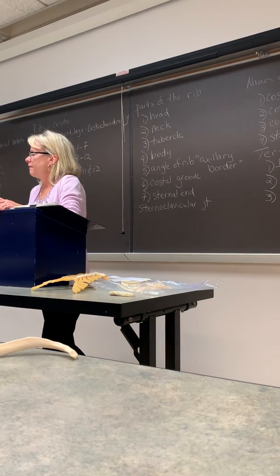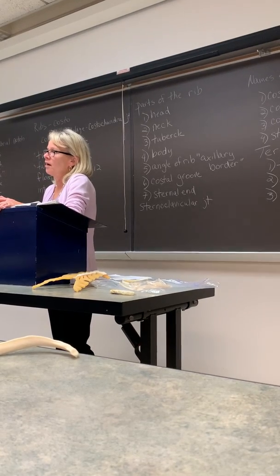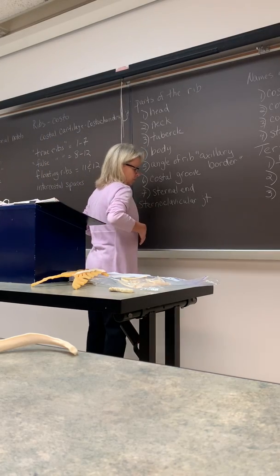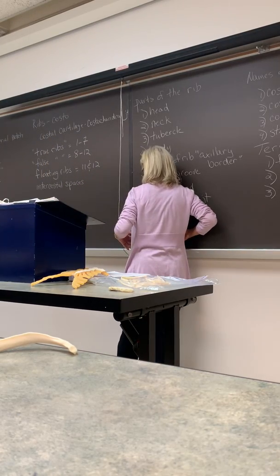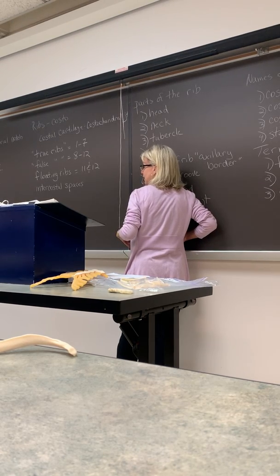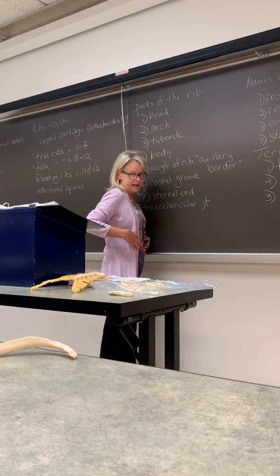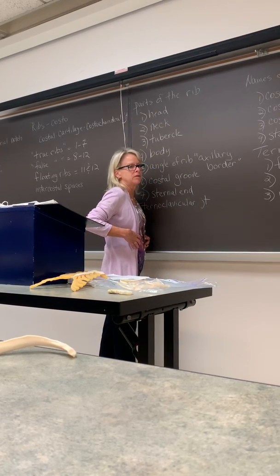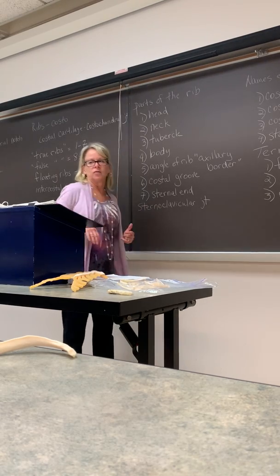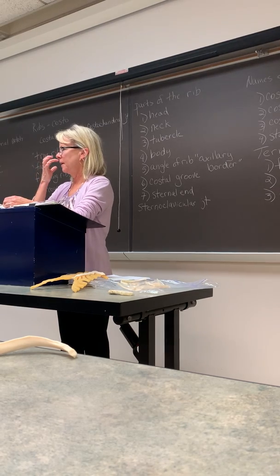Okay, so it's the affected side down if you're AO, if you want to put it that way. You said RAO demonstrates the right ribs elongated? Correct. You told us LAO was the right side. Okay, take that off. LAO left ribs.